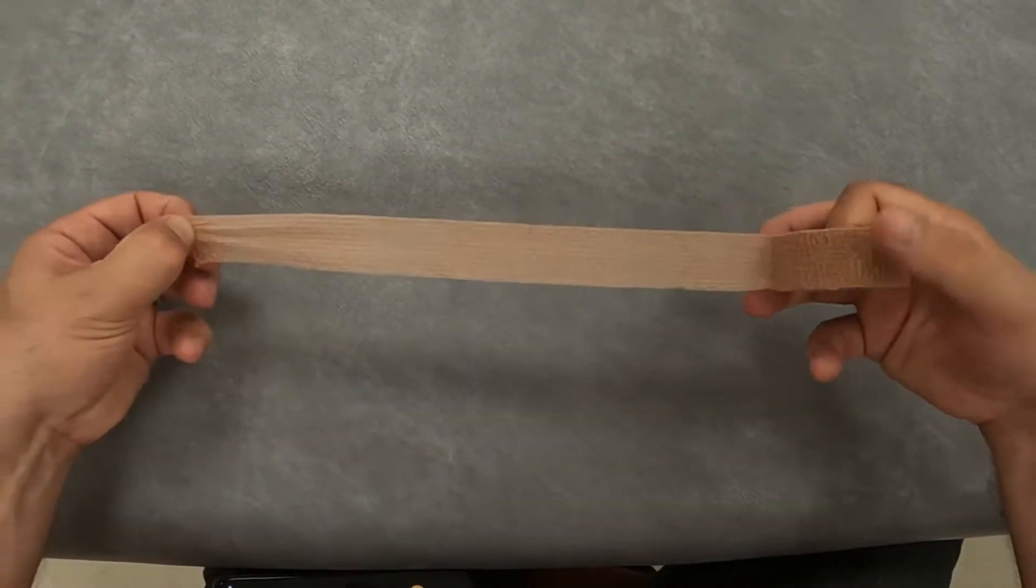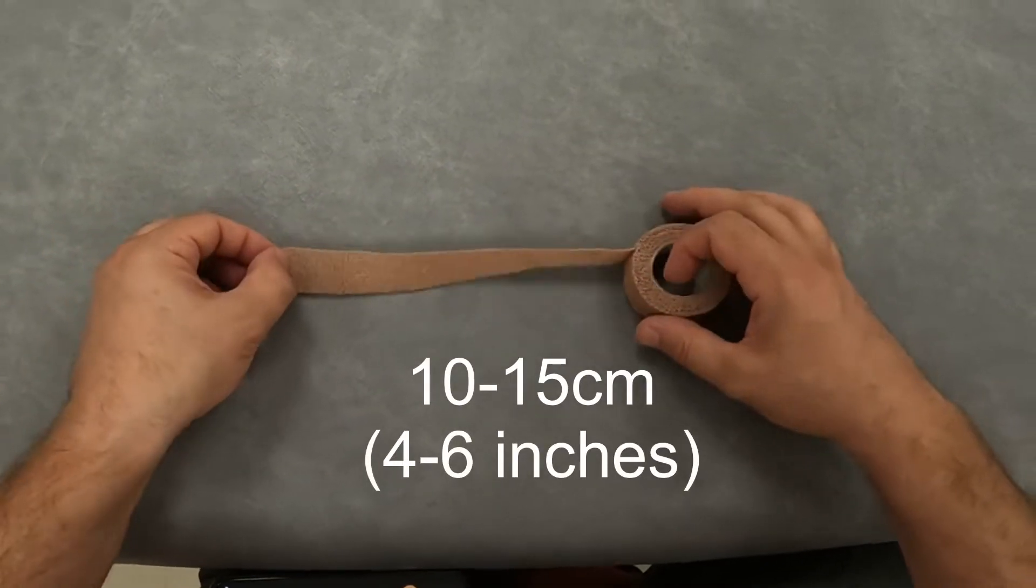For most finger joints, a length of about 10 to 15 centimeters is about right.